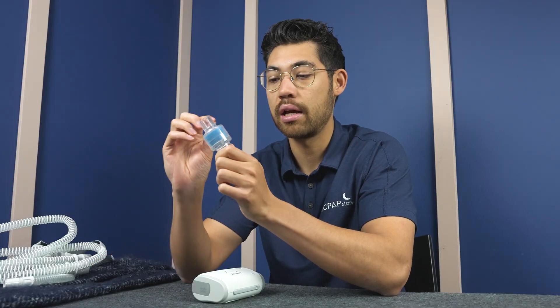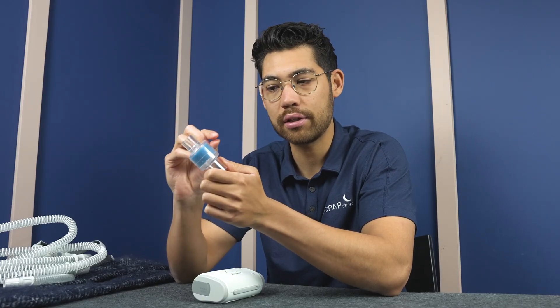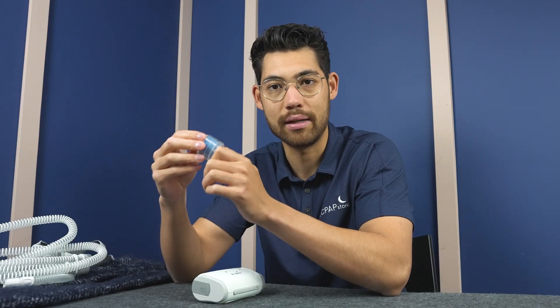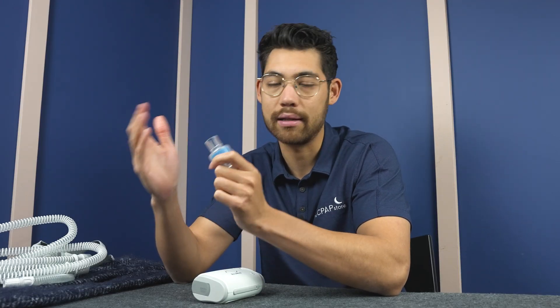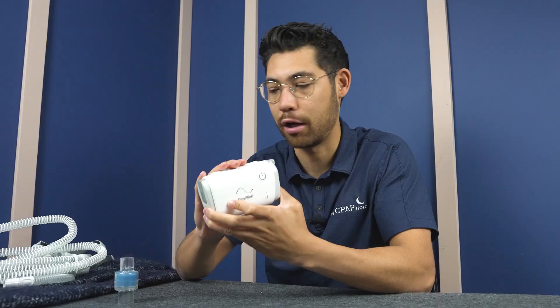So this here allows the moisture from your breath — your exhaled, expired air — to be filtered in this foam filter part here, and it's going to keep some of that humidity. So you have both humidity and clean filtered air. We commonly recommend filters like these for machines like this, the ResMed Air Mini.